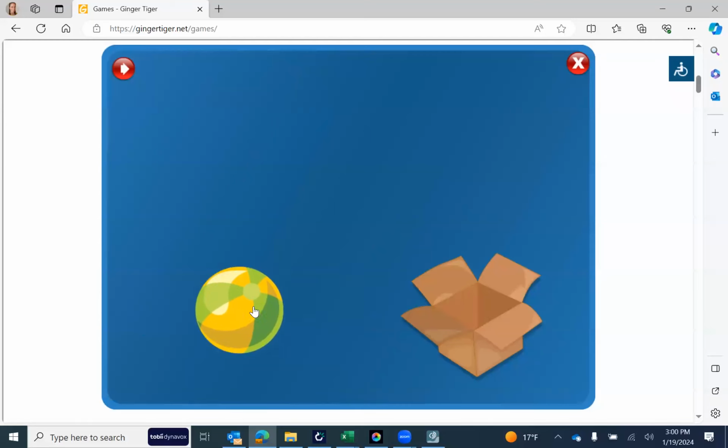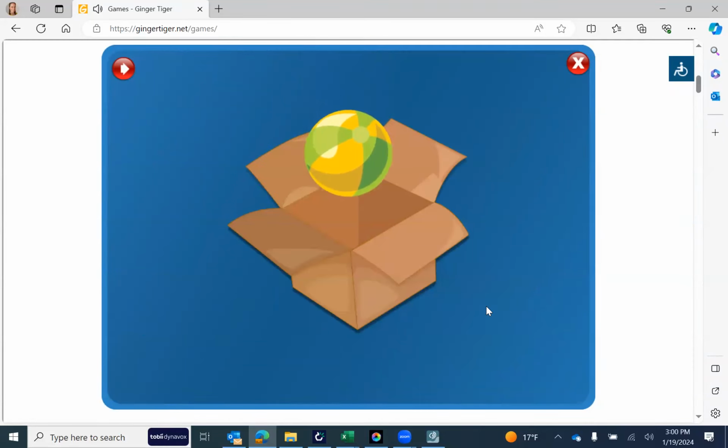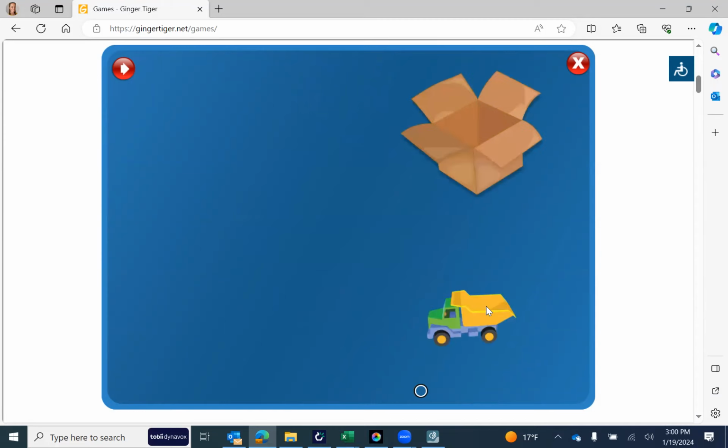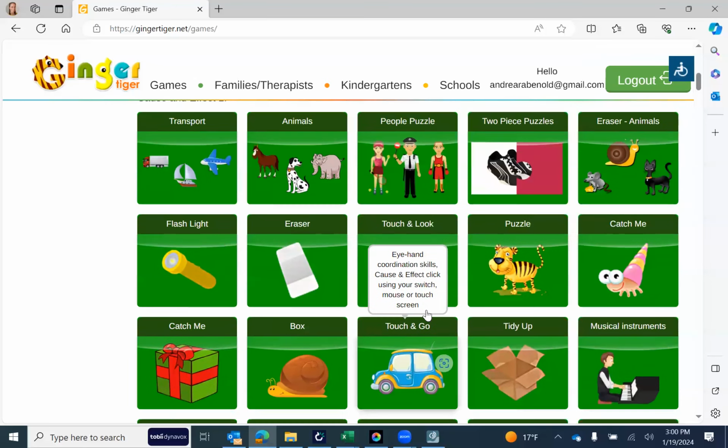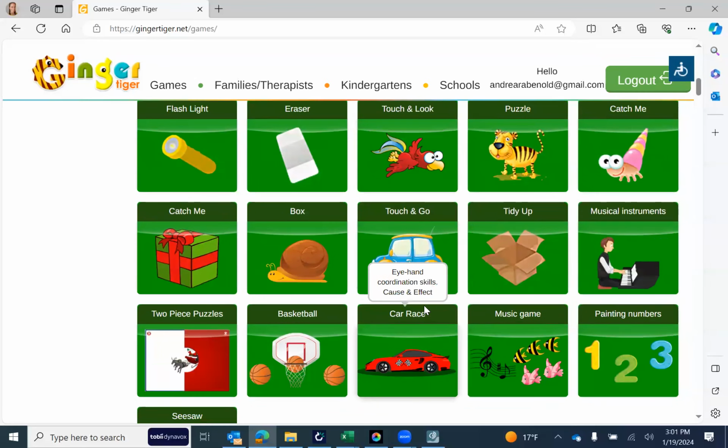Yep. So now I'm using my mouse. So this is an example of why you might need, down the road, more mouse functions than just that left click. But some of these activities are very well suited for just using a simple click. All right, so that was a super quick intro to TD Control, which, just like Gaze Point, can be simplified for kids who are learning computer access to just provide a simple left click function for you to click and make choices in a web browser or in another Windows program.